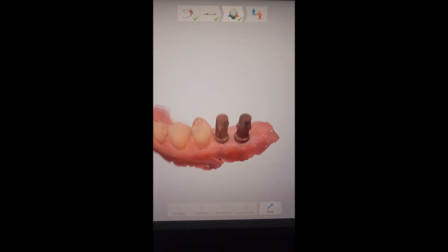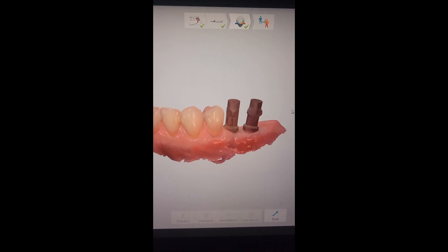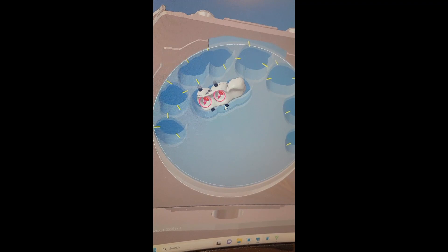We first take a scan — an optical scan — of these posts screwed onto the implants themselves, and then that gets sent to computer-assisted design software where the shape of the bridge actually gets designed.